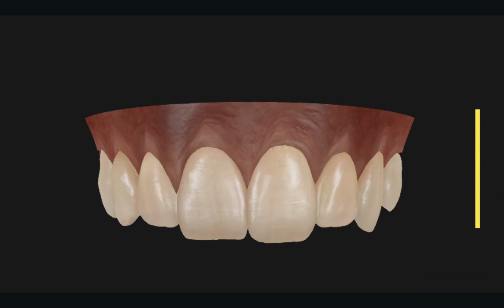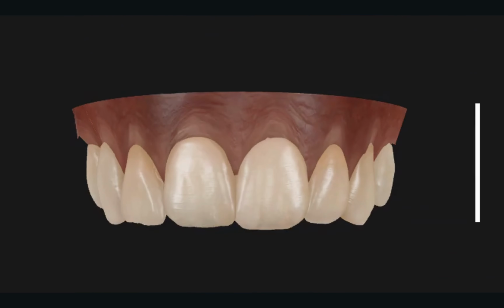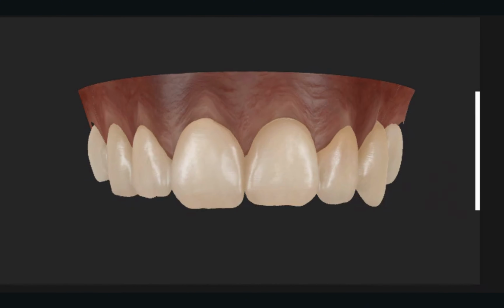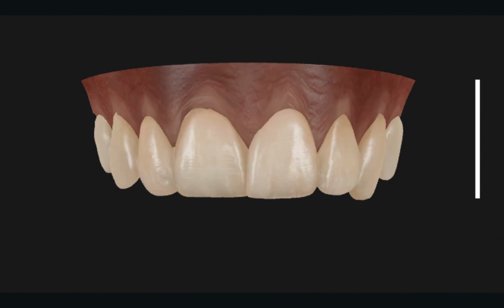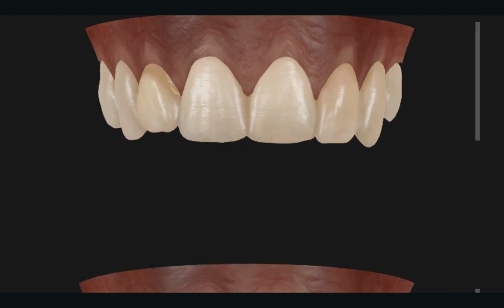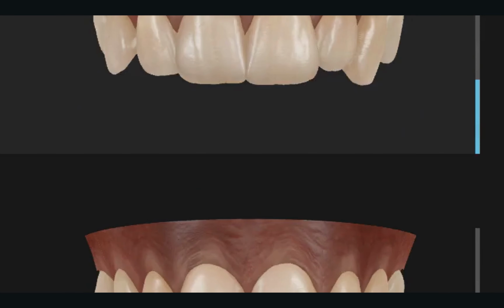And so this is the key phase where you're putting in this data based on what is existing there or what you're proposing to do. And it spits out all of these different options, all these iterations with these little tabs on the right-hand side of different colors. Significance of that is it tells you how closely anatomically that file is associated with the data that you've inputted on the current situation.